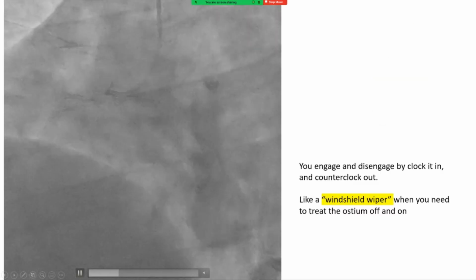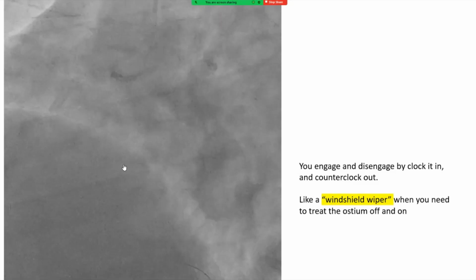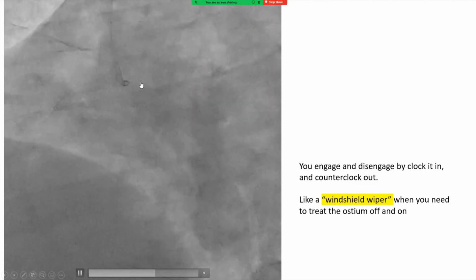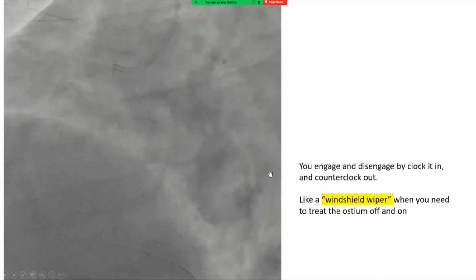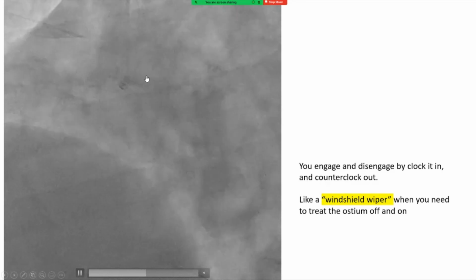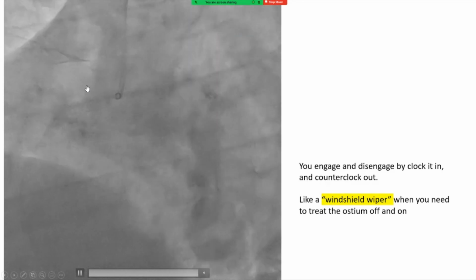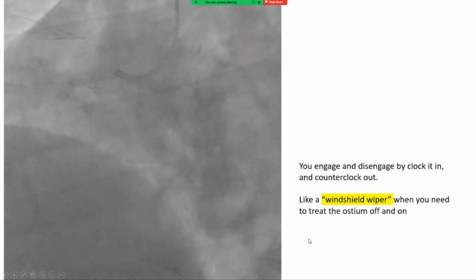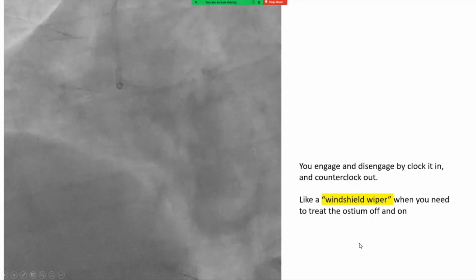See here how we're not deep in with the duck shape, and we can counterclock out and clock in. This is the windshield wiper maneuver. You counterclock out and clock in. You see, it's like a windshield wiper. Clock, counterclock. You engage and disengage.